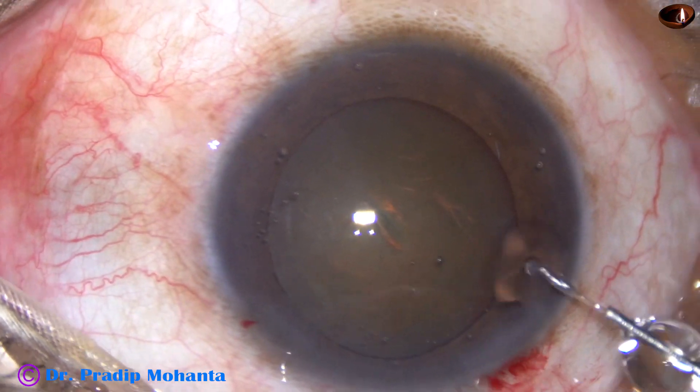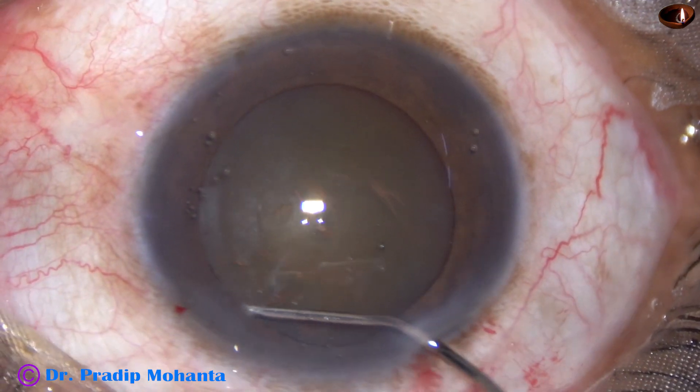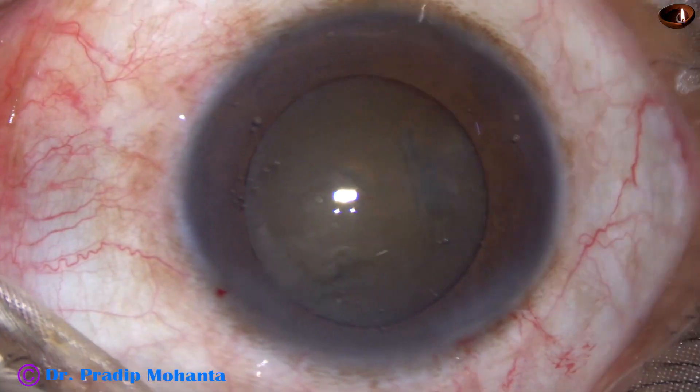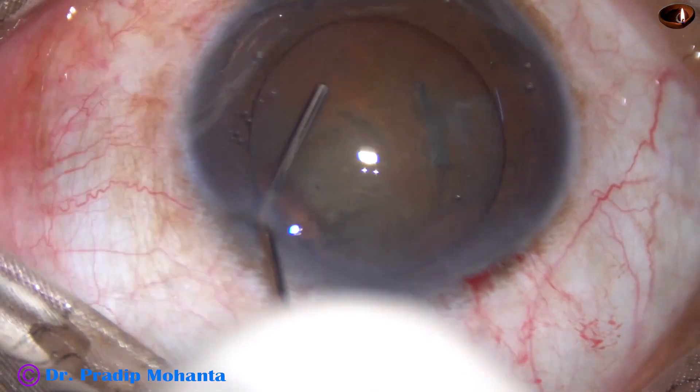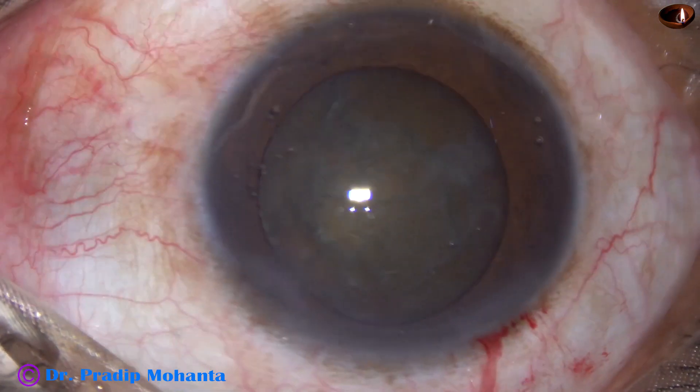Hydrodissection is done. BSS is passed under the anterior capsular rim. Fluid wave goes to the opposite equator. The nucleus is tapped and the nucleus is rotated.